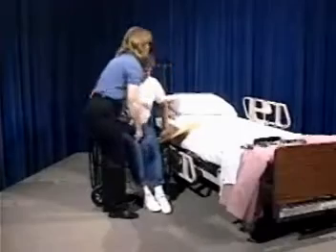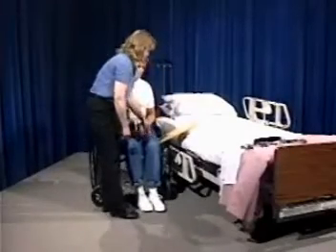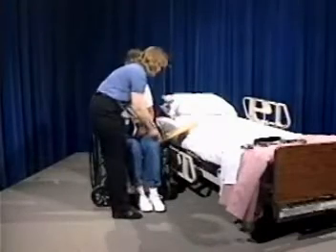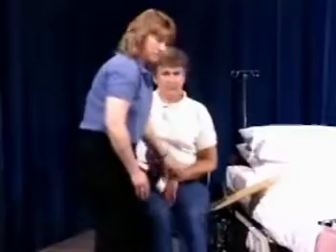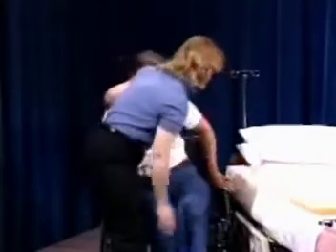It's usually a very smooth transfer. Get the surfaces as level as you can to make it easier. Once they're safely and comfortably in the chair, she can shift her weight again for me to the side, and the board can be just wiggled and pulled out.